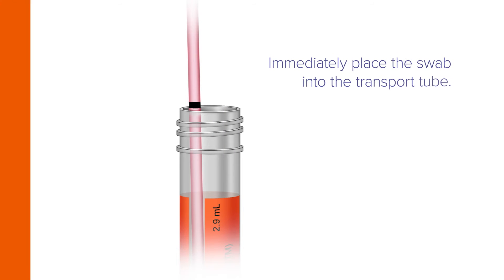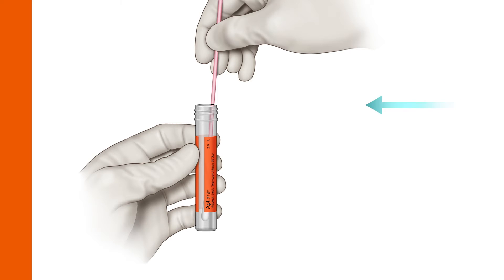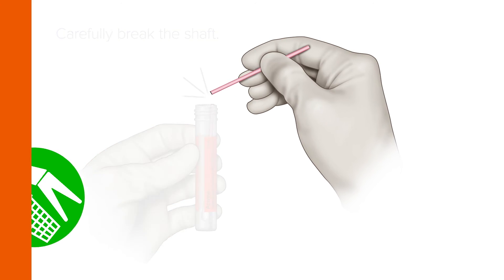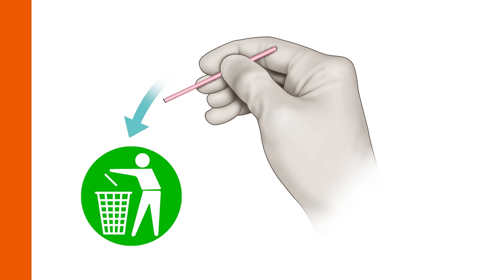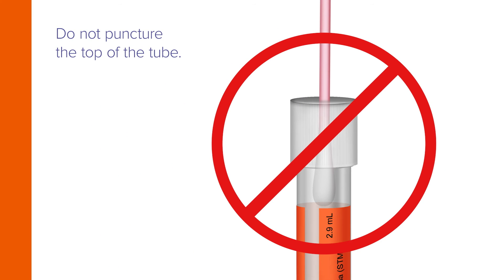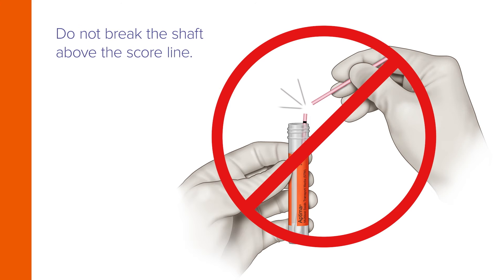Immediately place the swab into the transport tube so the score line is aligned with the top edge of the tube. Align the score line with the top edge of the tube and carefully break the shaft. Discard the top portion of the shaft. Do not puncture the top of the tube. Do not break the shaft above the score line.